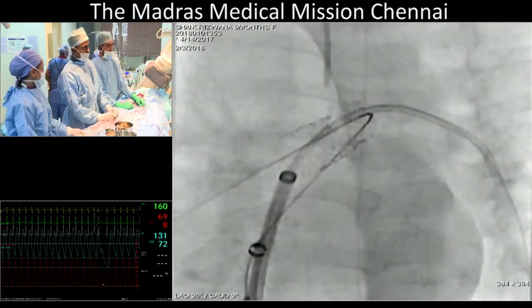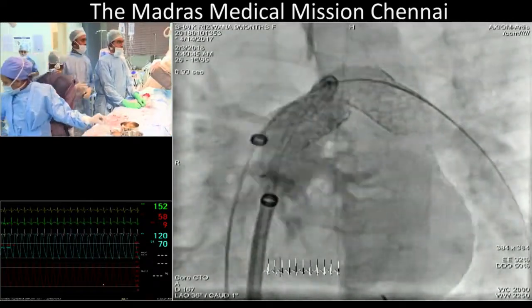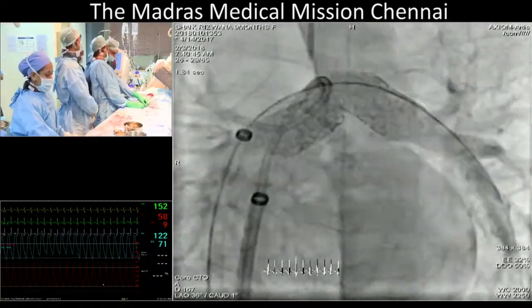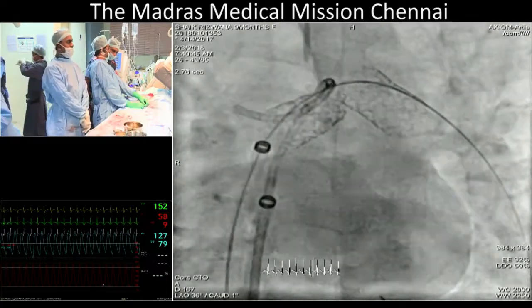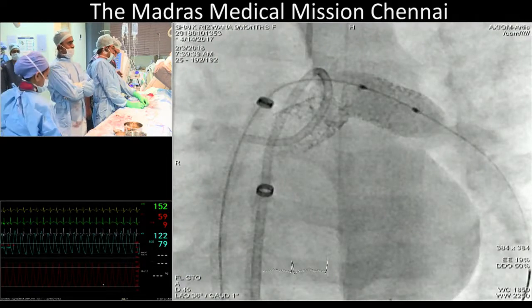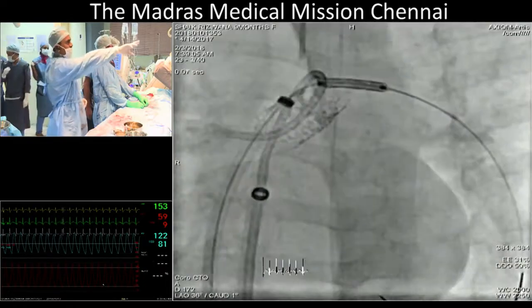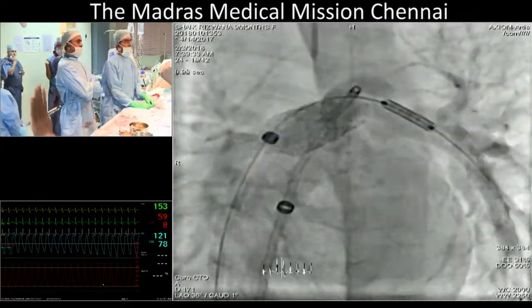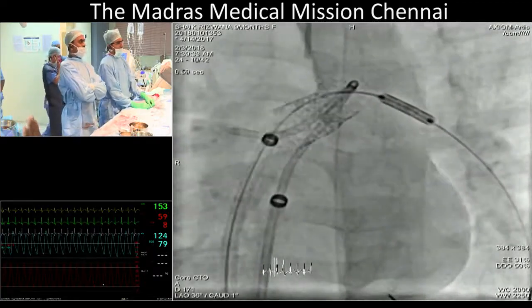Yeah, so Shiva, we'll come back to you. We're just going back to Tin now. Okay. So what are you seeing, Shaq, with you? See, there's that. Show the previous picture. So what we did was we took an 8 into 12 Formula 418. Yeah, I think this is fine. So this is the positioning of the stent. From this position, this was actually at the ostial and the proximal LPA. So we withdrew a little bit back.